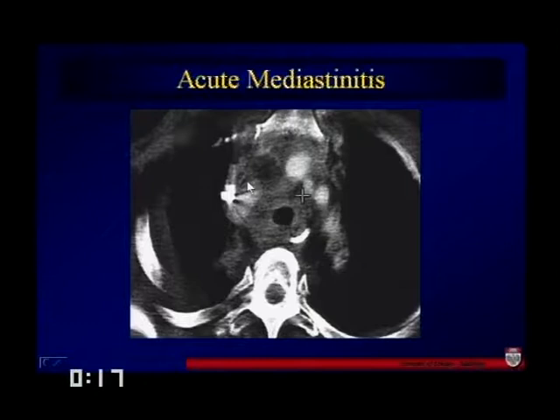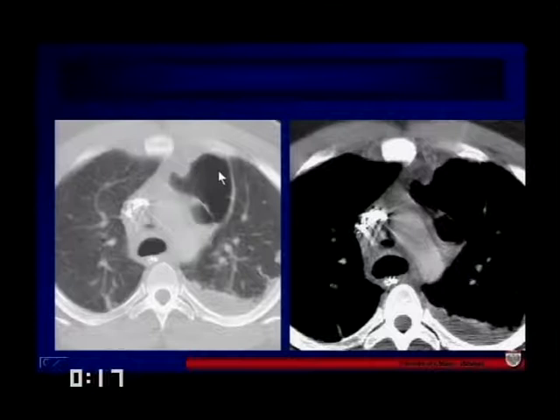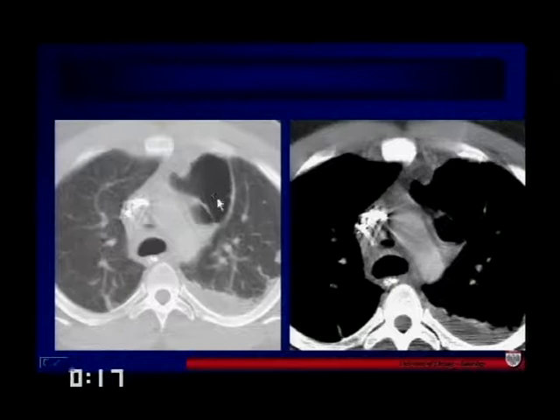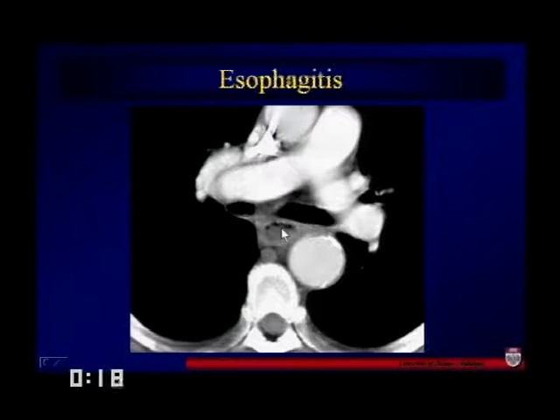This was a surgical complication with a large fluid collection from esophageal perforation that collected anteriorly and to the left — now you can see it's drained out. This is an acute mediastinitis from intervention. Other kinds of inflammation in the mediastinum can include the esophageal region — here we have a thick esophagus with some debris and irregular walls. This is a patient with HIV who has a candida esophagitis, an infectious esophagitis with debris inside and irregularity of the esophageal wall.